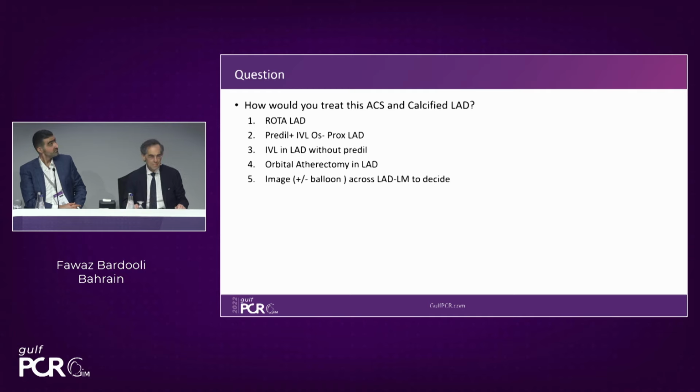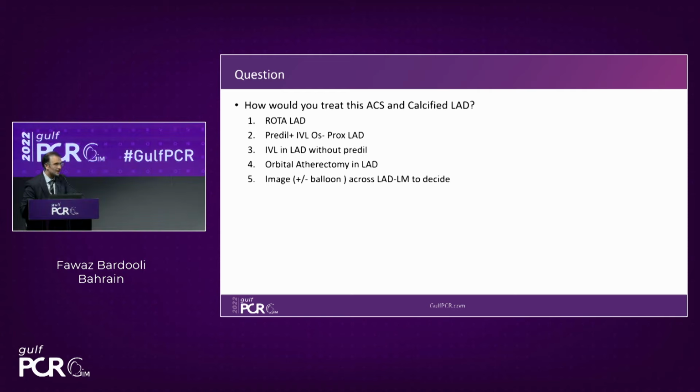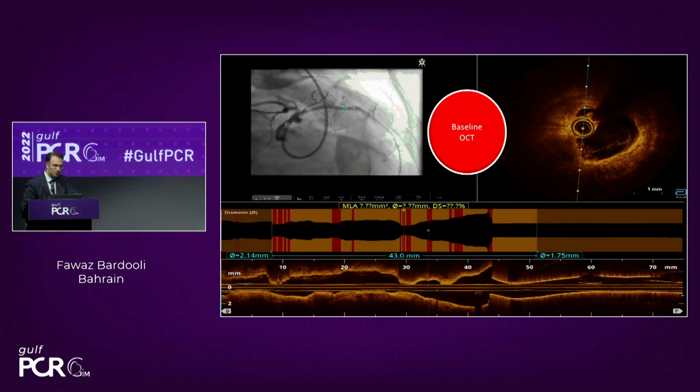Okay, so I hope everyone has answered this question. I'm going to go ahead now and show you what the operator did, and we'll take it step by step and see what happens.